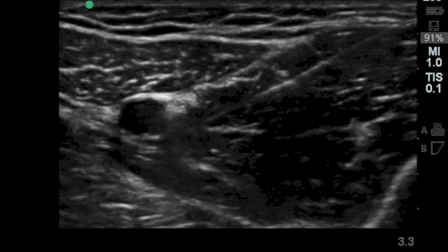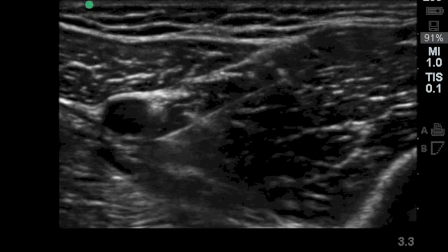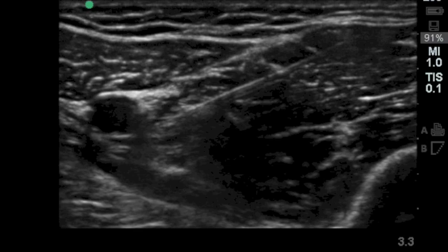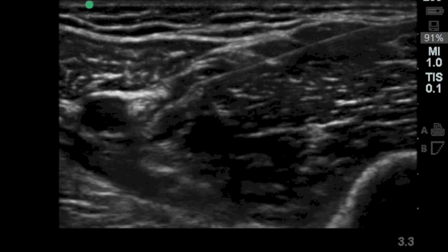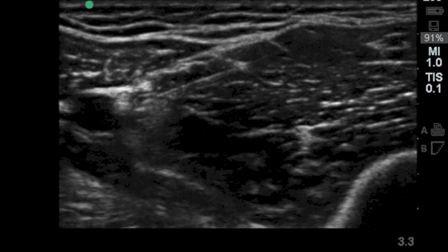We're going to go for a corner pocket view. The saphenous nerve is visualized there, just lateral to the femoral artery, and you can see us beginning the injectate now in that space. About 10 cc's of local anesthetic should be sufficient to get an excellent saphenous nerve block, which you can use in conjunction with the popliteal sciatic block to provide total analgesia into the foot. The needle is slightly redirected to make sure we're getting good coverage, but the principles are the same — avoid intravascular injection and ensure good local spread underneath the fascial plane.